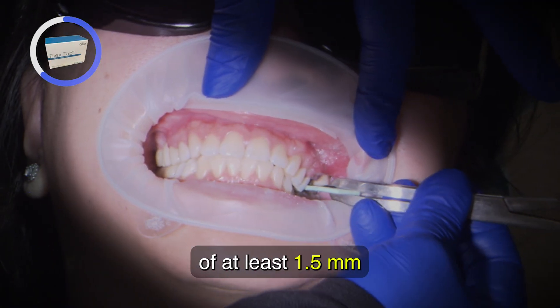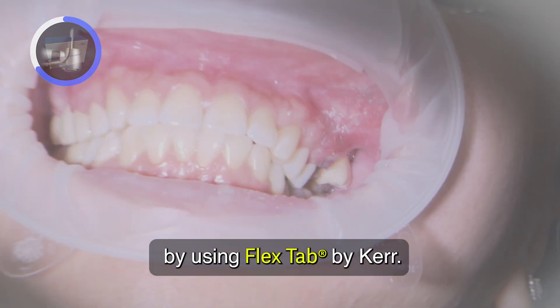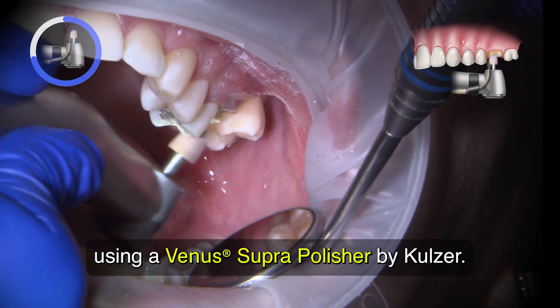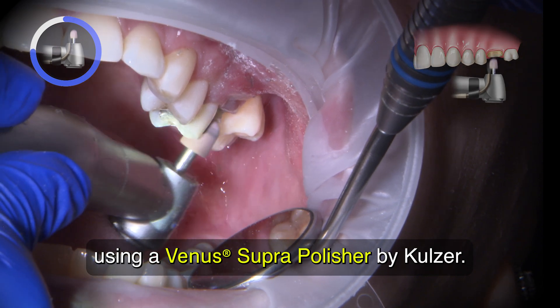Make sure to check occlusal reduction of at least 1.5 millimeters by using Flex Tabs by Kerr. I refine the prep with fine diamond burrs and soften sharp prep line angles using a Venus Supra pre-polishing point by Kulzer.